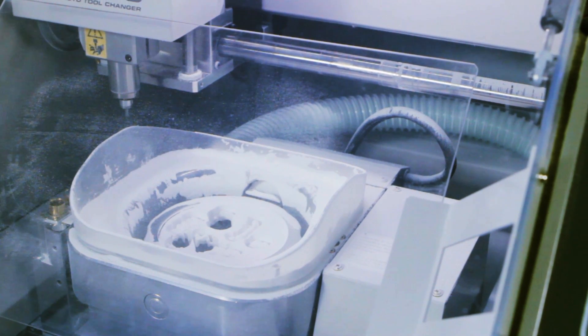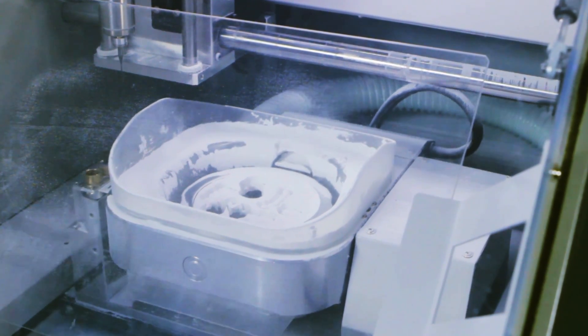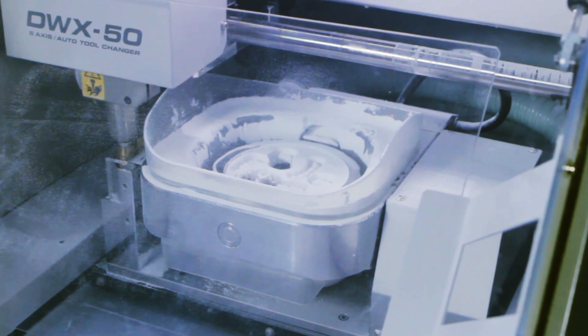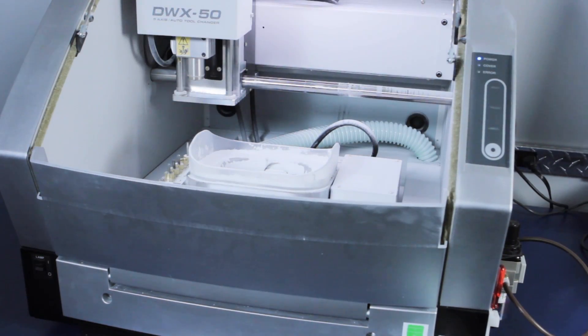One of the most important aspects of keeping your DWX50 working with the most optimal results is to clean your mill thoroughly and regularly. Once you complete your milling job, this process can easily be done using a couple of simple items.